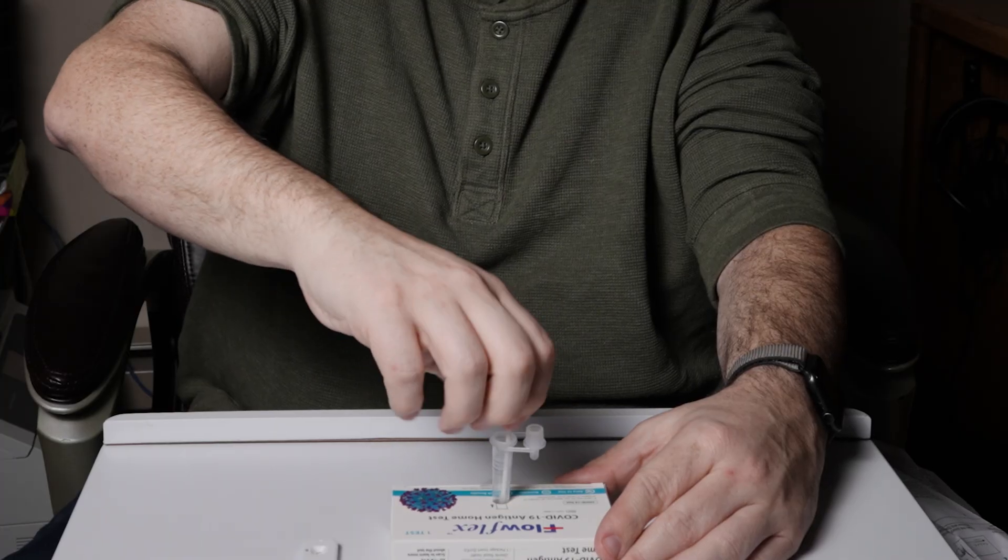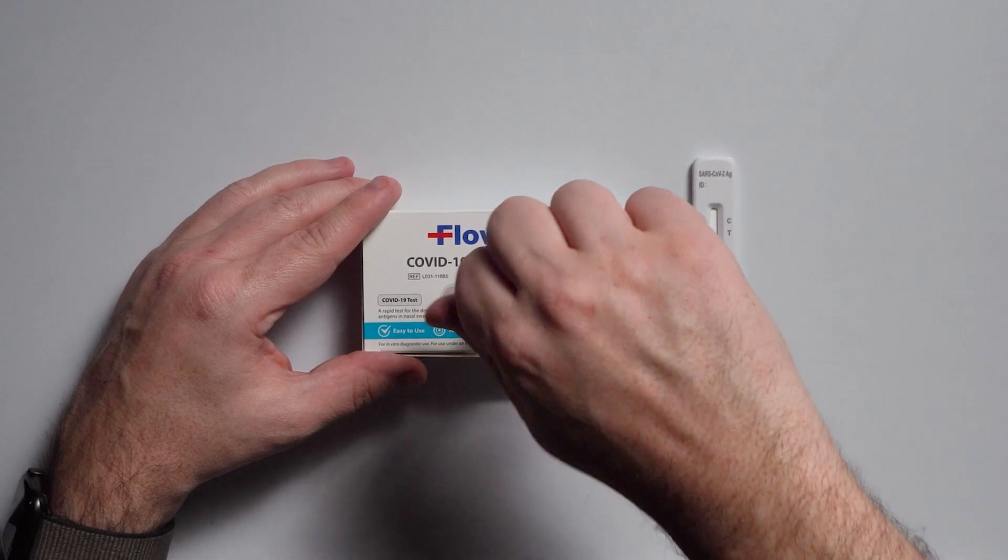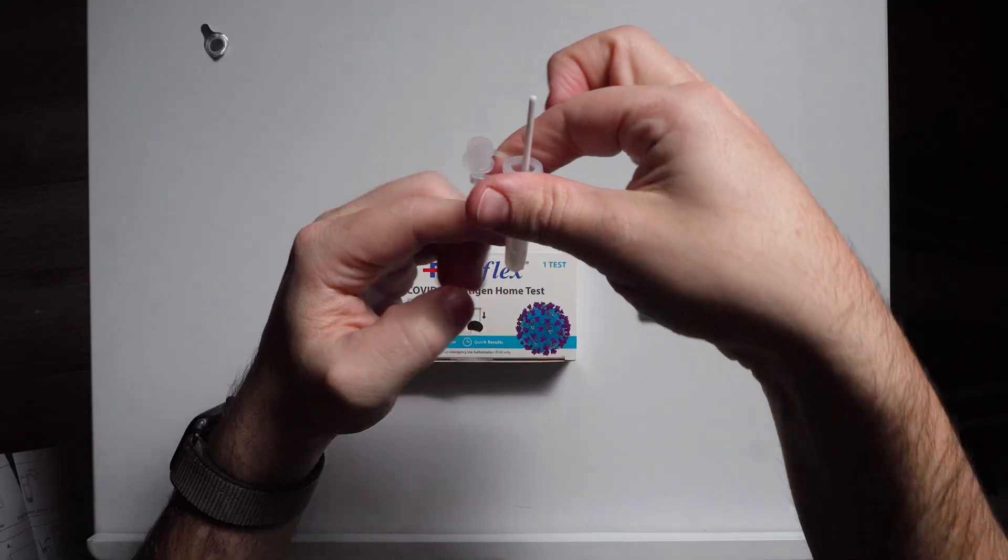Put it into my little beaker or my testing tube. We're going to spiral this back and forth. Now we're going to take this out — firmly hold with your hands — squeeze the tip, and turn again about five times.